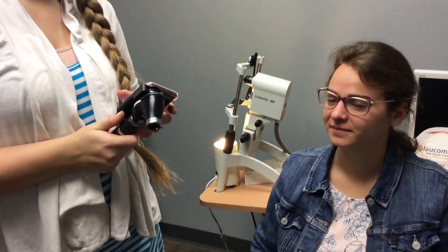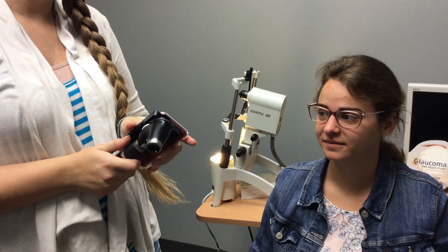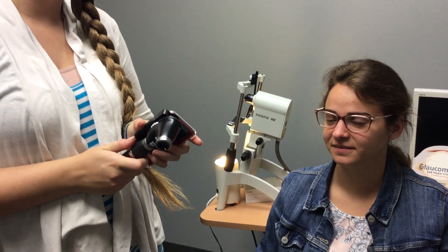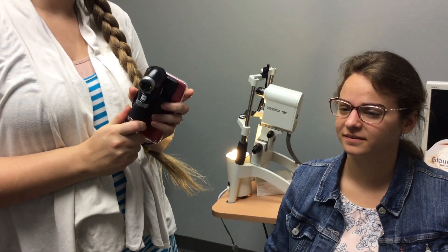This is Heather and this is Kimberly. We're going to show you how we use the panoptic photo taking instrument. Kimberly will show you how she does it and talk you through how we do it.